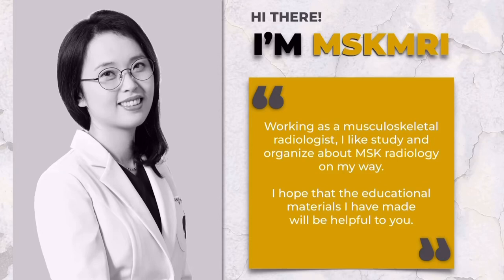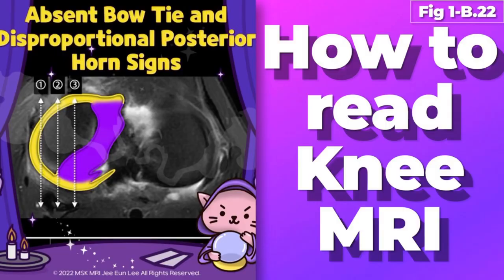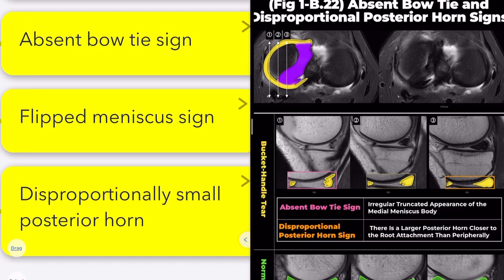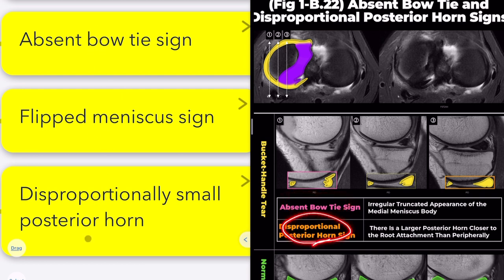Hello, I'm Siyuni from MSK Marai. Today, we'll examine several radiologic signs to identify bucket-handle tears, focusing on the absent bow-tie sign, flipped meniscus sign, and the disproportionately small posterior horn sign.